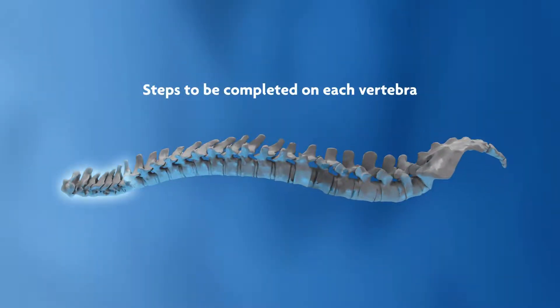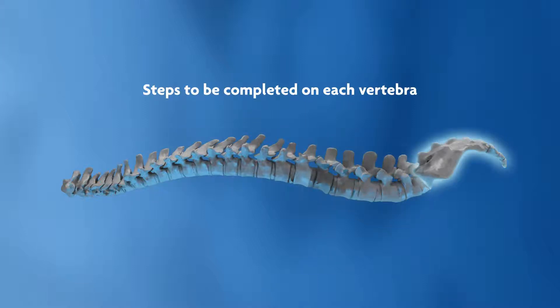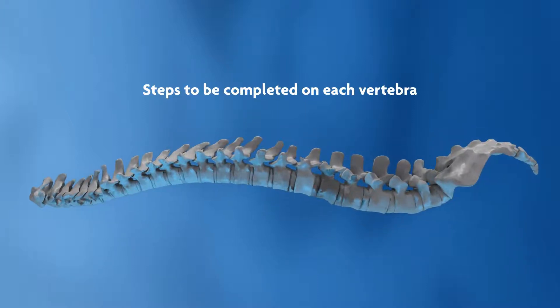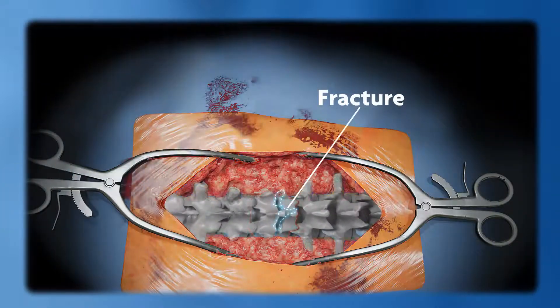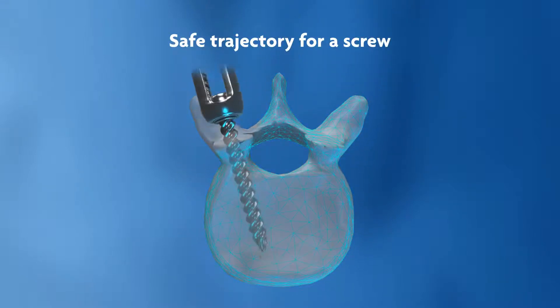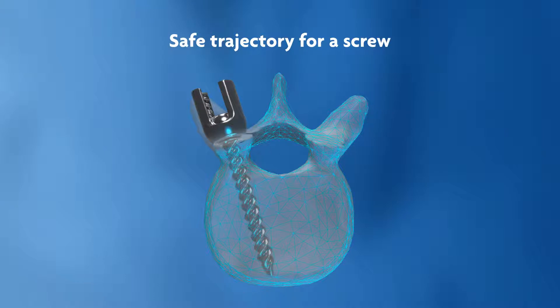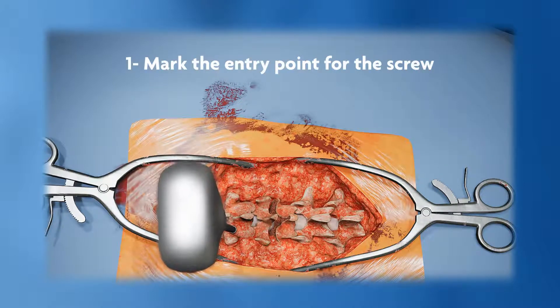Here are the general steps that should be completed on each vertebrae after exposure by a posterior approach. A safe trajectory for a pedicle screw is a straight line between the dorsal cortex and the anterior cortex of the vertebral body through the safe zone of the pedicle. The trajectory should always remain inside the vertebrae.